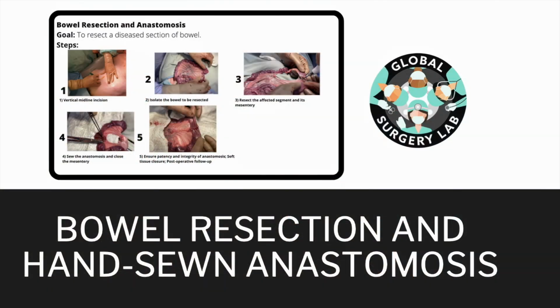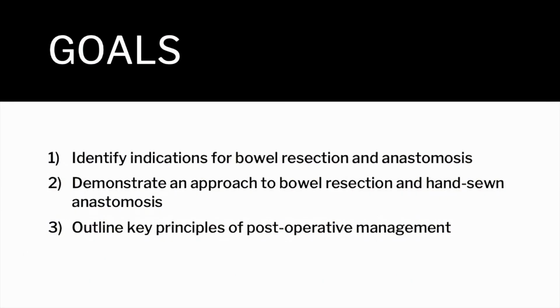The Global Surgery Lab presents an approach to bowel resection with hand-sewn anastomosis. The goals of this video are to: 1. Identify indications, 2. Demonstrate a step-by-step approach, and 3. Outline key principles of post-operative management.